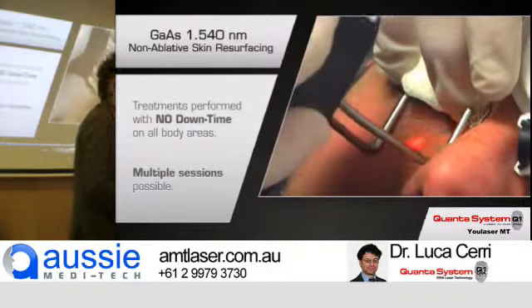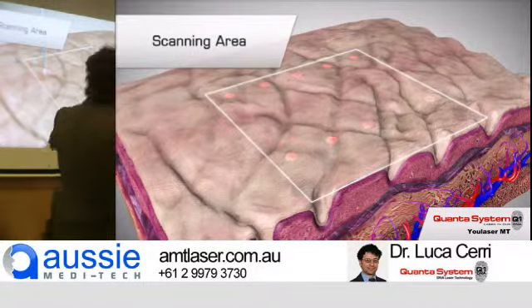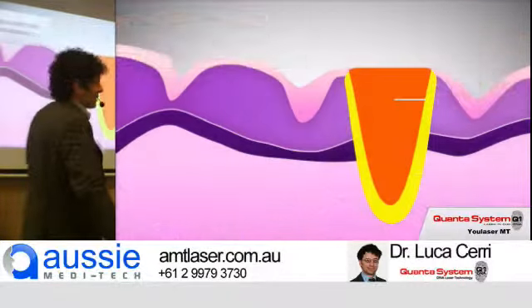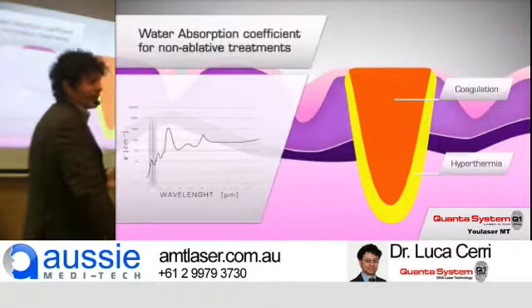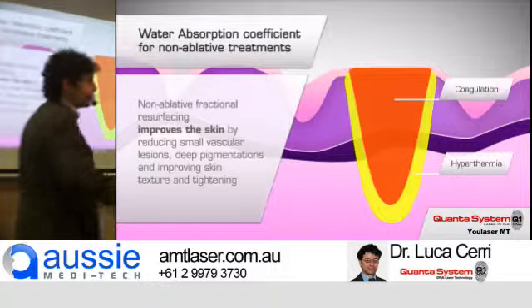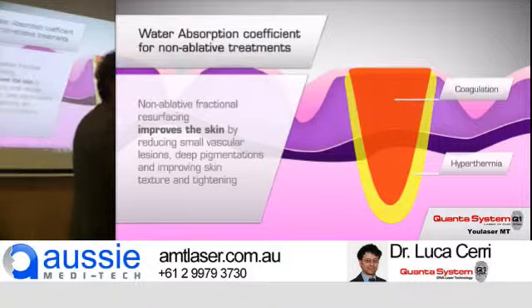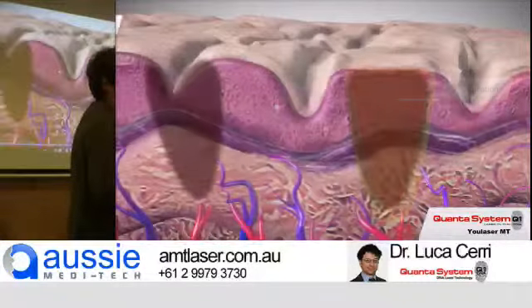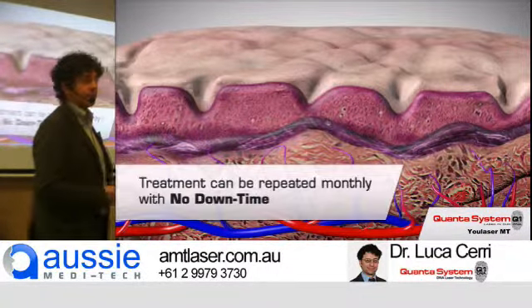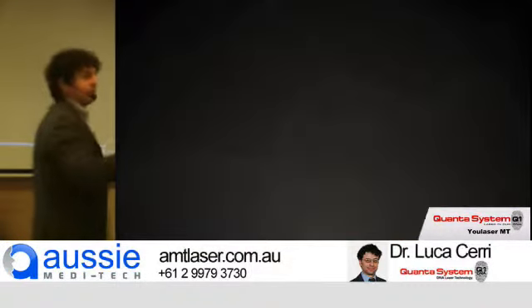The device, anyway, can be used as a standard single wavelength device, just non-ablative, in case of need of a really non-ablative treatment with zero downtime. It can be used as a normal 1540. In this case, we cannot apply it on superficial pigmentations or deep wrinkles because there are minimal results. So we know the potential of both wavelengths. We are not pushing the same wavelength for everything. You have the possibility to choose the best choice for each patient.